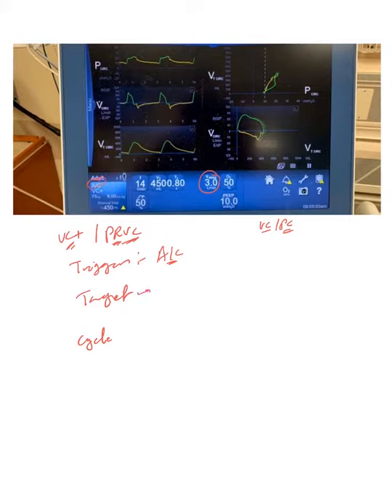The target is pressure target. And as we explained in the last two videos, the initial breath is usually given as volume control, flow target, to deliver this set tidal volume. The initial test breath will tell us how much pressure is needed to deliver the set tidal volume. Then we'll use that pressure and switch to pressure target using that pressure.